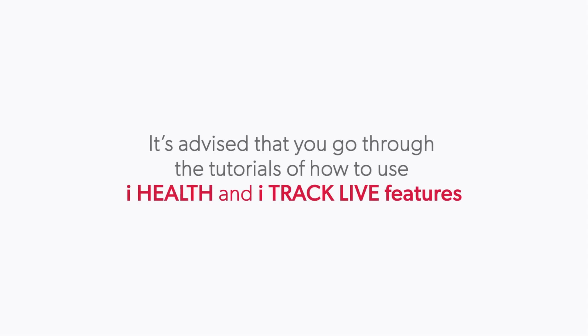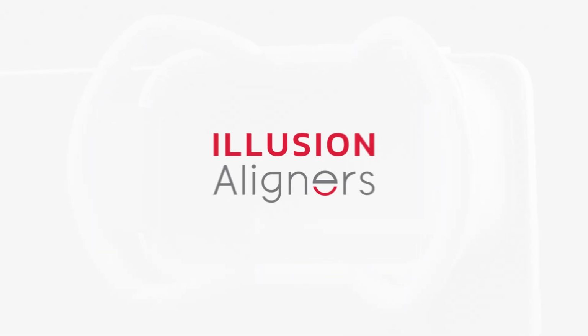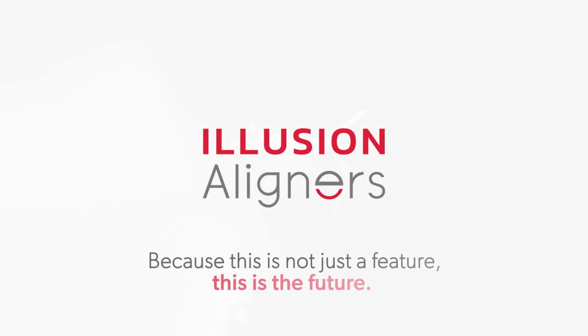It's advised that you go through the tutorials of how to use iHealth and iTrack Live features. Because this is not just a feature, this is the future.